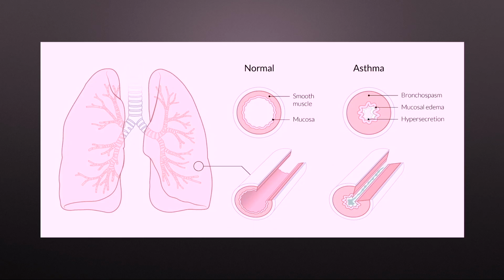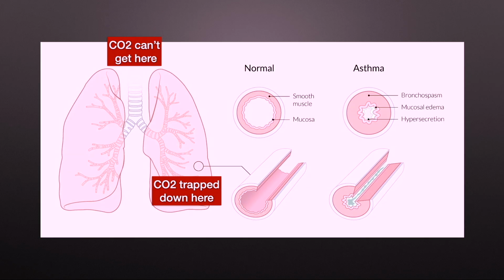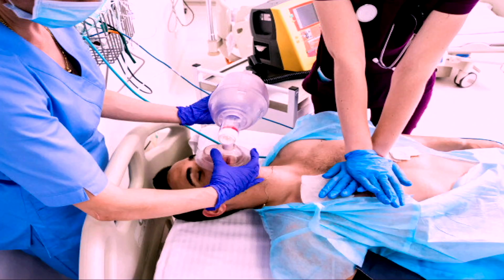Another case where that might actually happen is if you have bad obstructive lung disease and you trap air down in your lungs because it can't get out, and so you're just not able to get it up past the sensor. Now that has to be pretty severe at that point, but it certainly can happen. Or it could happen because the patient has essentially low or no blood flow to their lungs themselves, as we kind of mentioned before. So it's very difficult to say.